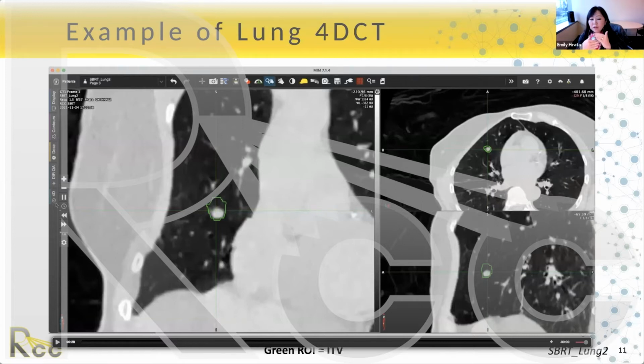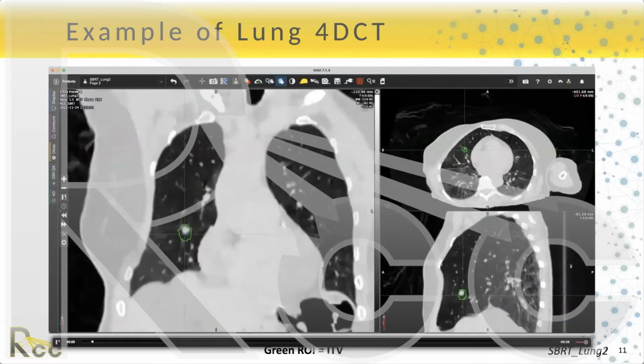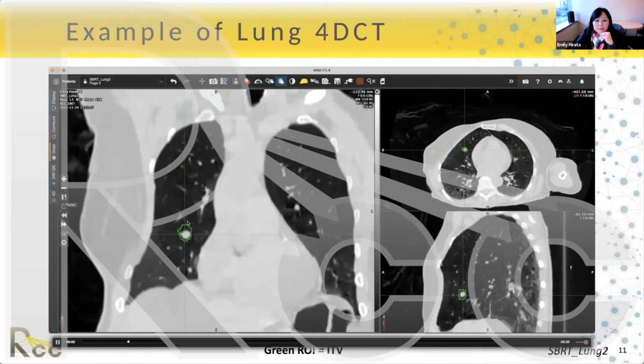If you just take your inhale and exhale images, it's important to use larger margins because of that error, since you're not going to see that information in the middle of the respiratory cycle. Yeah, so those points help to adjust the margins on the lateral end. Right. Exactly.